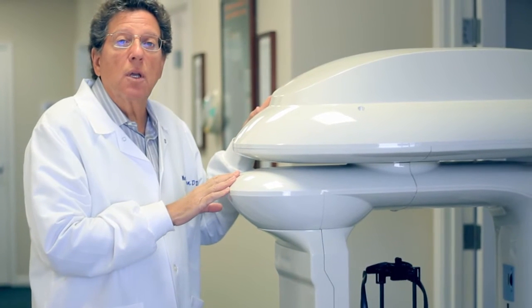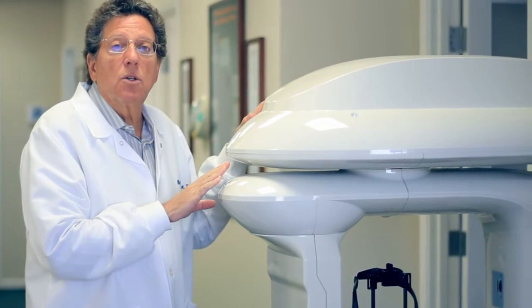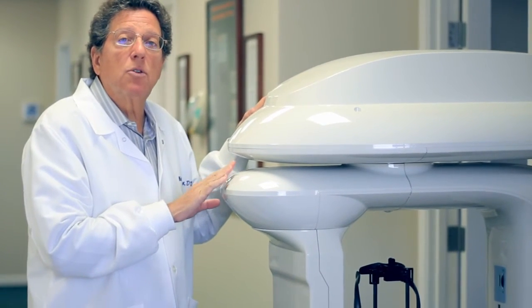And thirdly, we can use this machine to check for how much bone you have in case you're in need of implants.